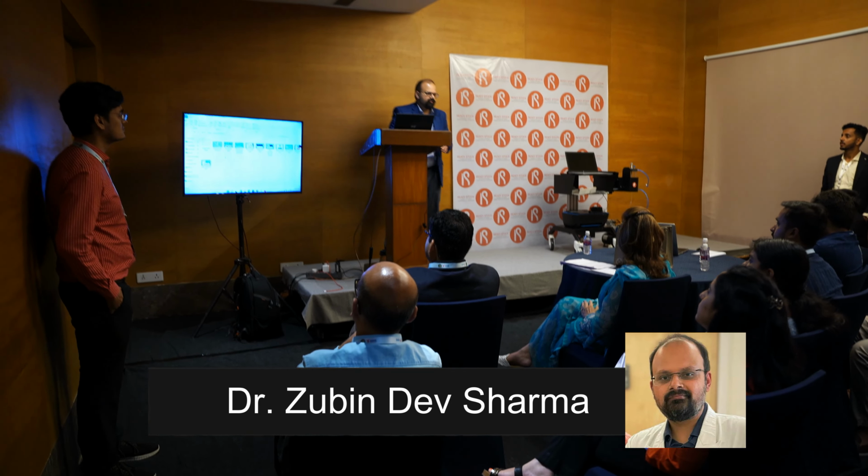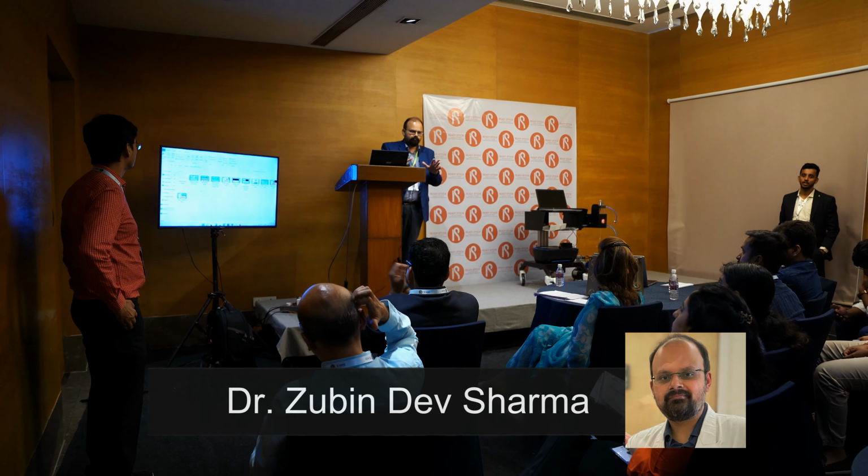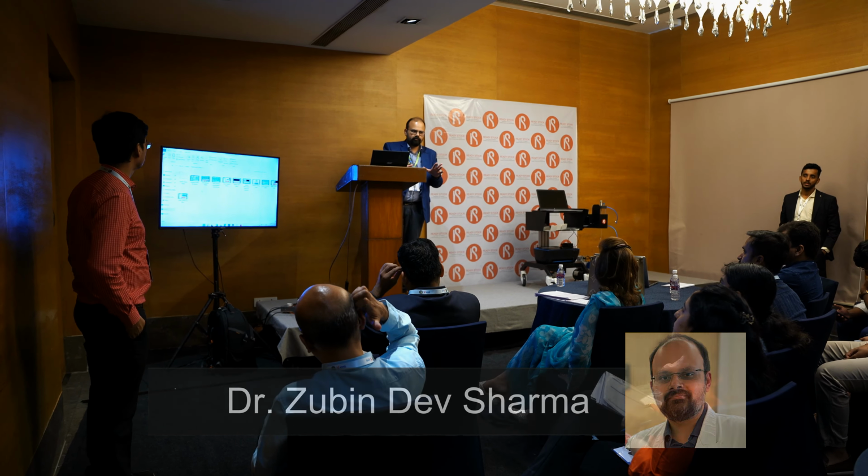We all are aware how we start the machine and set it up for the manometry. If that is clear, I'll directly go on to the actual recordings.